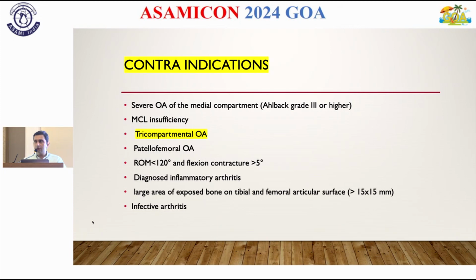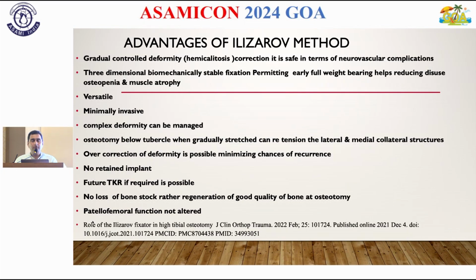So the absolute contraindications are tricompartmental osteoarthritis, and infective and inflammatory arthritis. So what are the advantages of Ilizarov? Gradual deformity correction is possible. It is a three-dimensionally stable construct permitting early mobilization. It's versatile and minimally invasive. It can manage both mild to moderate and severe deformities.